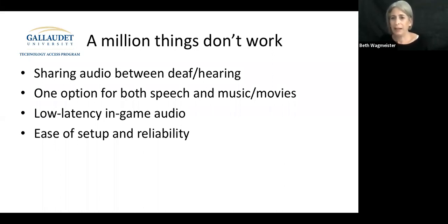So it just depends on the reliability; the ease of the setup would be very reliable. Sometimes it connects and sometimes it doesn't. So that's very frustrating and it's very confusing, it gets messed up. So if I have an iPhone with my CI, it connects, and we could apply the ease of the setup and it's a very good experience. Next slide, please.